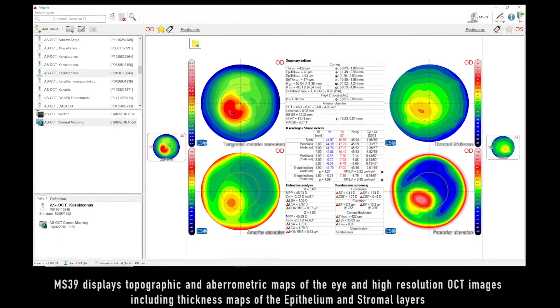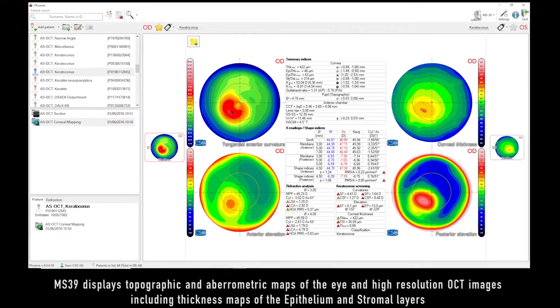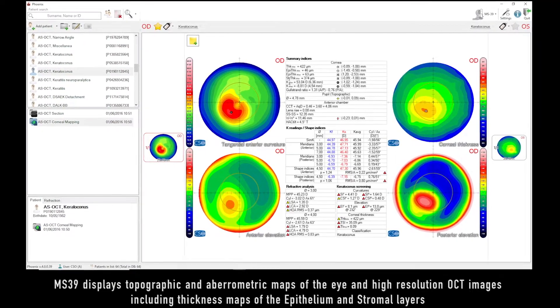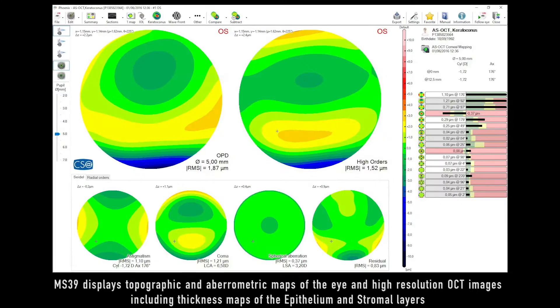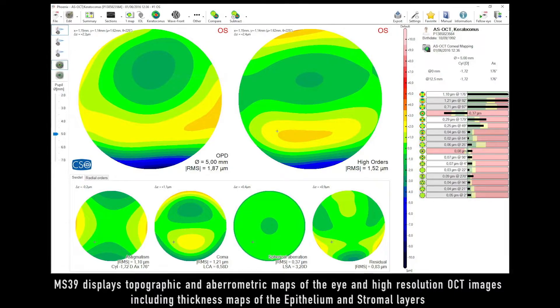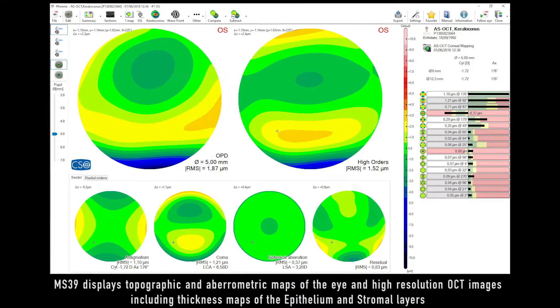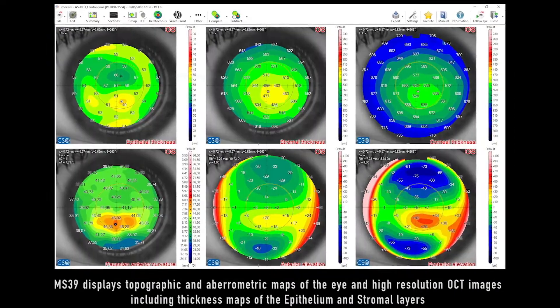MS-39 displays topographic and keratometric maps of the eye and high-resolution OCT images, including thickness maps of the epithelial and stromal layers.